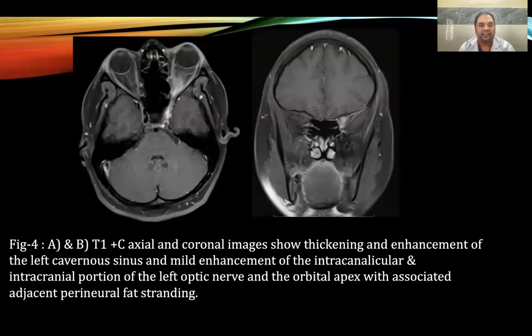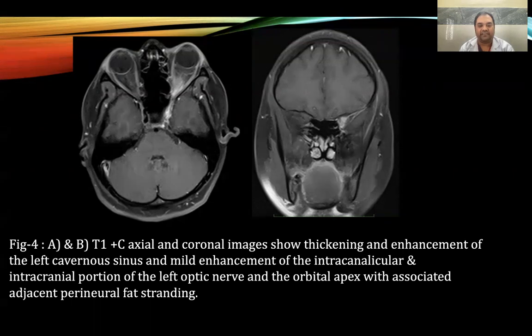Figure 4: Axial and coronal post-contrast images showing thickening and enhancement of the left cavernous sinus and mild enhancement of the intracanalicular and intracranial portion of the left optic nerve and orbital apex, with associated perineural fat stranding.